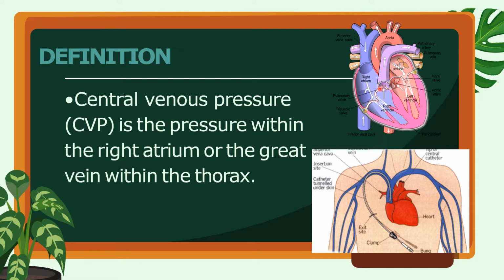The femoral vein is a compressible site and as such may be more appropriate for coagulopathic patients, while the subclavian vein approach is at higher risk for pneumothorax than the internal jugular vein approach.